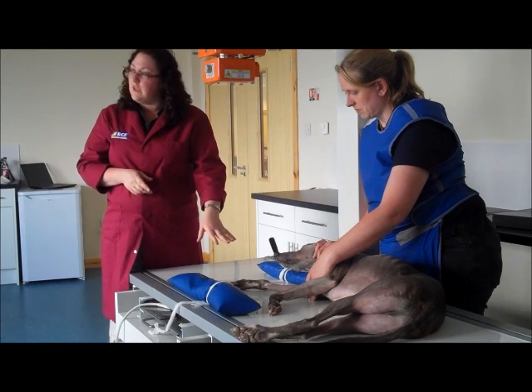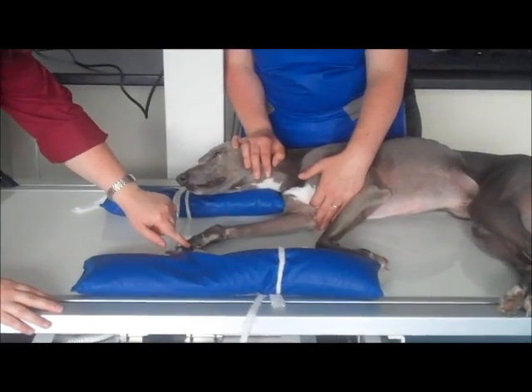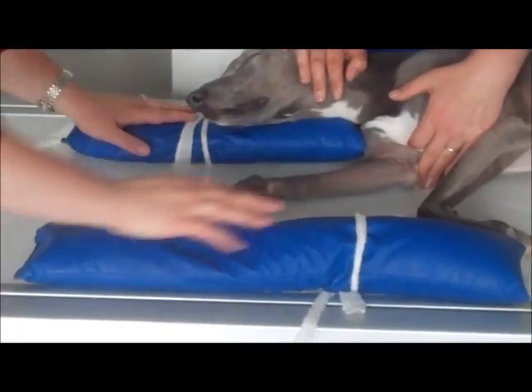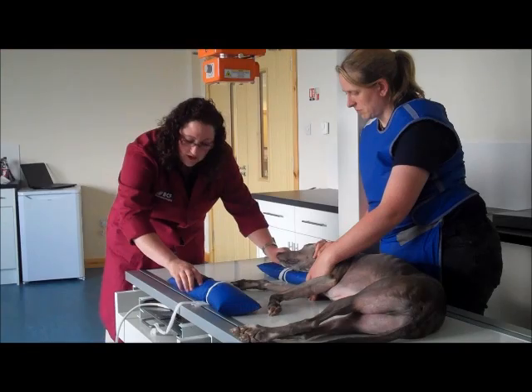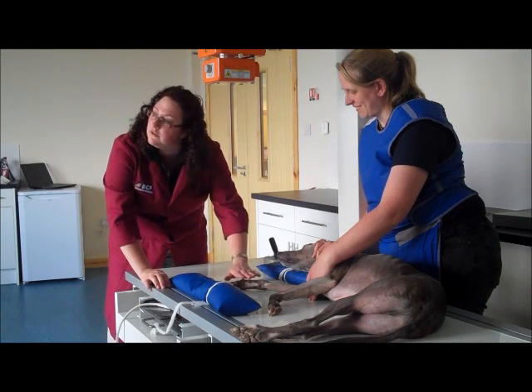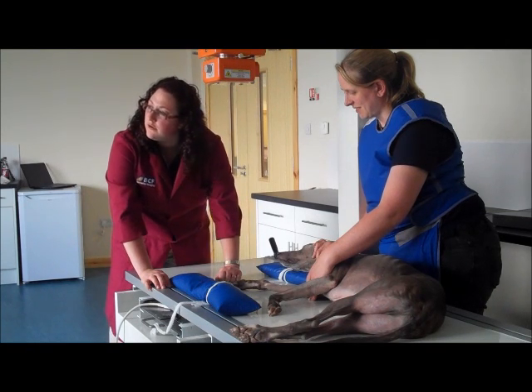So what we've done in this case is we've taken some of the gauze that we regularly have in practice and we've just placed it in a loop around digit 2 and digit 5, and actually used the sandbags as the form of restraint to separate them out. We want to be careful, especially in a conscious patient such as this, not to do it too vigorously because we don't want to cause any damage, but we've just separated them very gently so that we can evaluate all those structures individually.